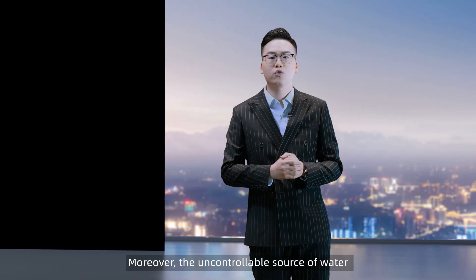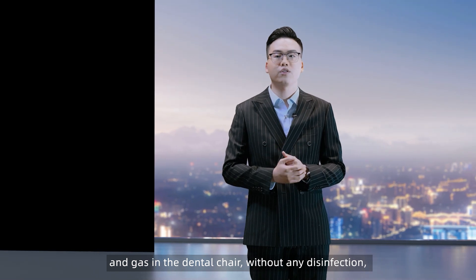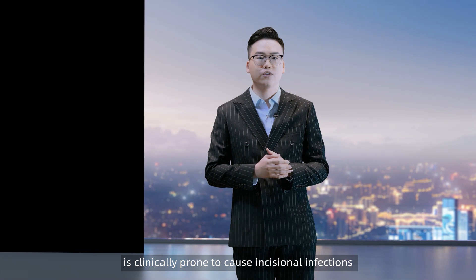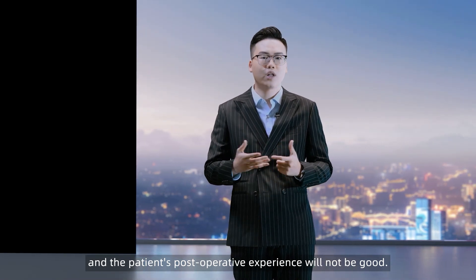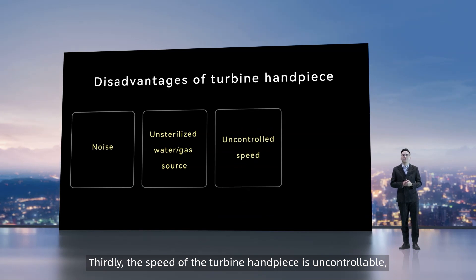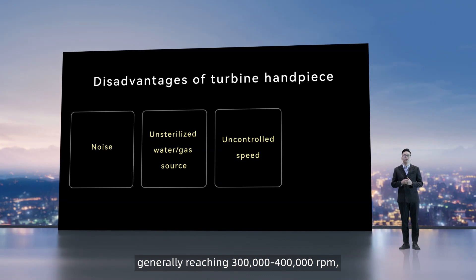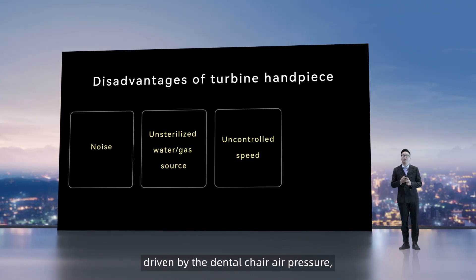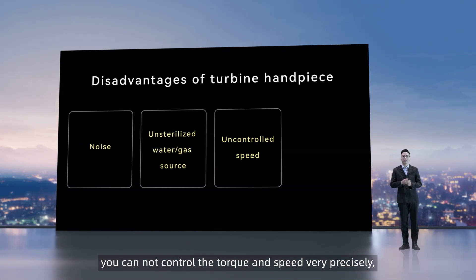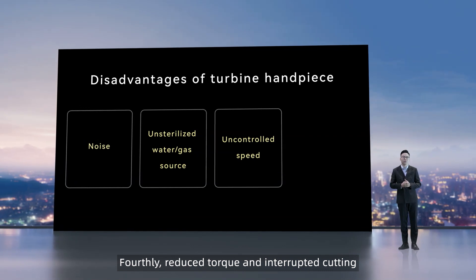Moreover, the uncontrollable source of water and gas in the dental chair, without any disinfection, is clinically prone to cause incisional infections, and the patient's post-operative experience will not be good. Thirdly, the speed of the turbine handpiece is uncontrollable — generally reaching 300,000 to 400,000 RPM driven by dental air pressure — so you cannot control the torque and speed very precisely, which can bring trouble to doctors and easily cause swelling.